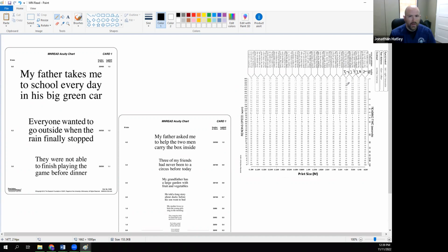Clinician would say, all right, we're going to move on to that next sentence. On your mark, get set, go. "3 of my friends had never been to a circus before today." So same thing, about 3.8 seconds here.